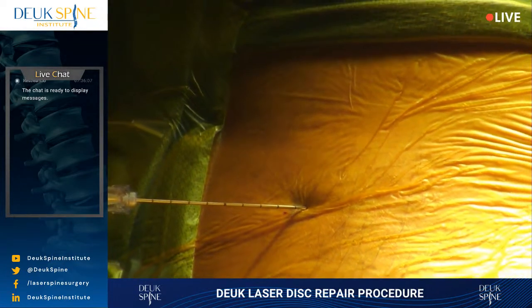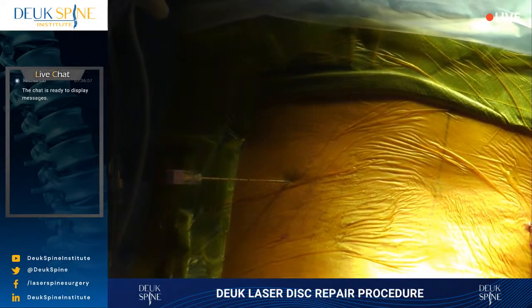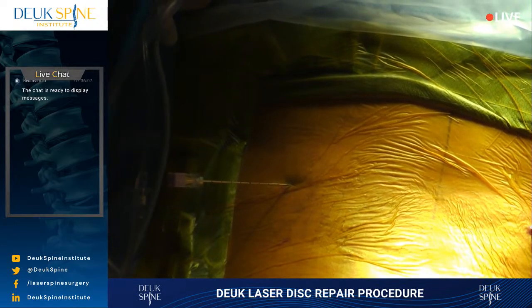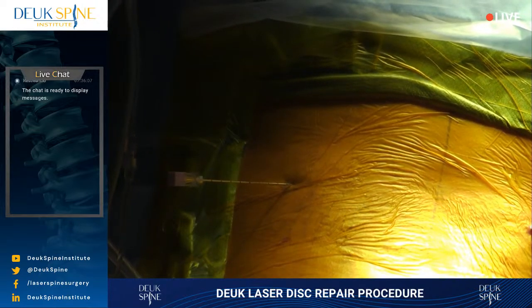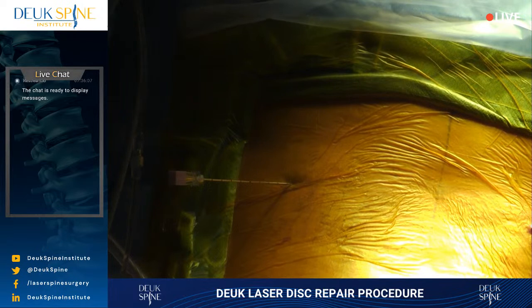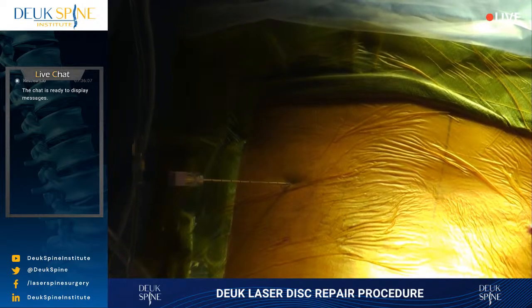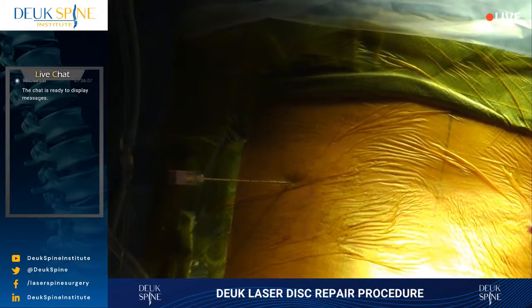Shot? All right, we need to get L5-S1 looking really crisp. Let's bring the fluoro south. Before I try to navigate to the disc herniation at each level, I want to make sure my X-ray machine, or fluoro machine, is lined up perfectly so that I have accurate information. Remember, the spine is three-dimensional and the fluoro pictures are two-dimensional. You don't get any sense of depth, but you have up and down and side to side information, front, back, and top to bottom, but you don't have that three-dimensional information. You're going the wrong way.